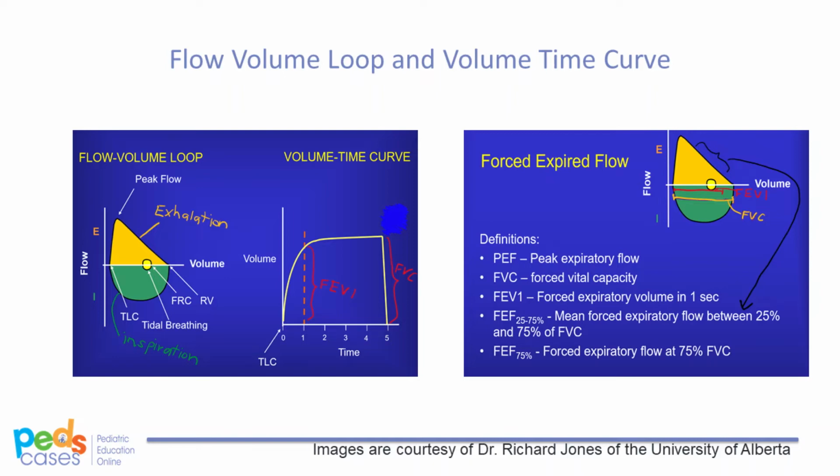When looking at the flow volume loop, the generation of negative flow corresponds to the negative portion of the y-axis, so you should ideally see an even half circle. This is the inspiratory limb. Then the patient blasts the air out as hard and fast as they can for as long as they can, even if it feels like there is no air coming out of their lungs.